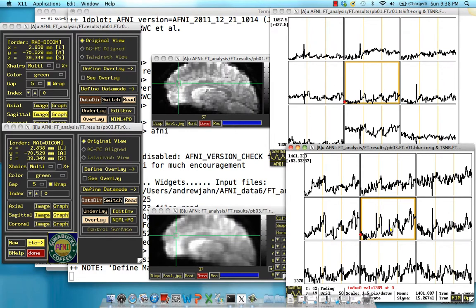For example, this one that I have right here looks pretty similar now to the rest of these voxels around here as well.